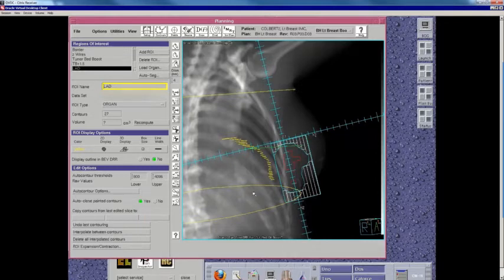And if you don't have a clue where the tumor bed is, don't give a boost unless there's some crazy reason why you really think you need to give additional dose, and then you have to just boost a big area and guess and hope that it's right. The second question then is, where is the tumor bed, and is it in a volume that is boostable?